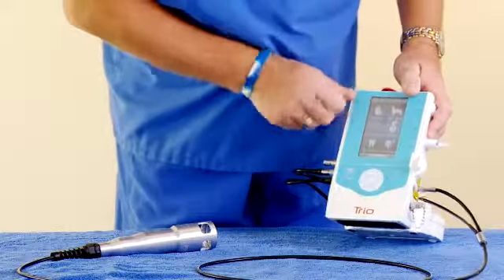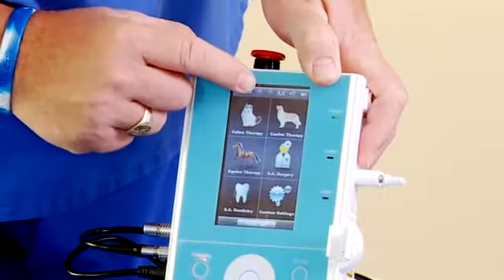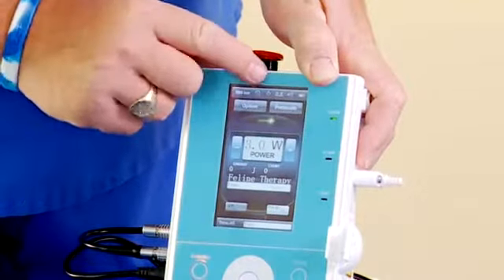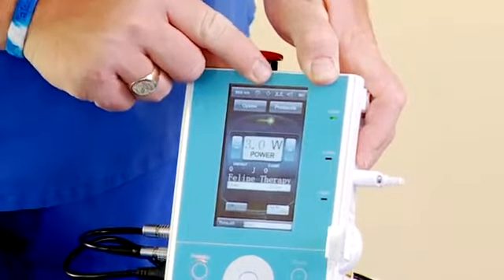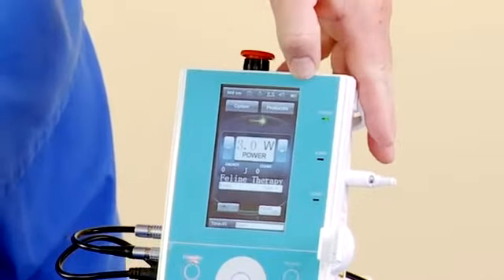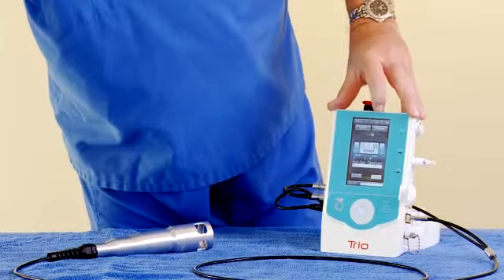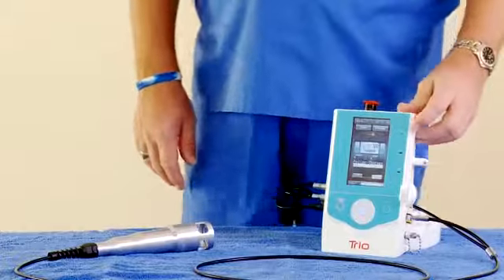And when we're running the laser, if we can see this on the film, we have our wavelength, we have our time. Up here it'll show as continuous or a wave. The wave indicates that you're in a hertz frequency. The continuous is one block up and straight, and that means you're in continuous mode. And the rest of it is battery power and the sound setting that you have on the laser at that time. And that is it.